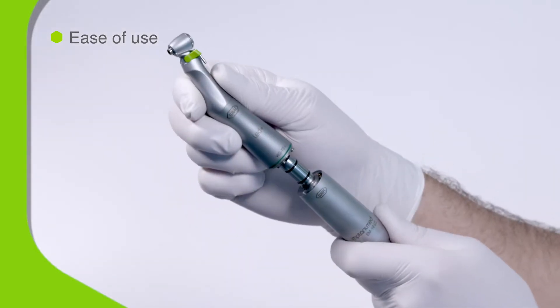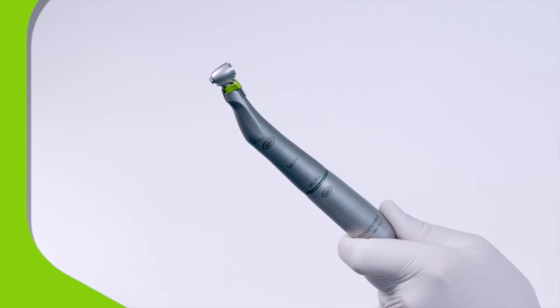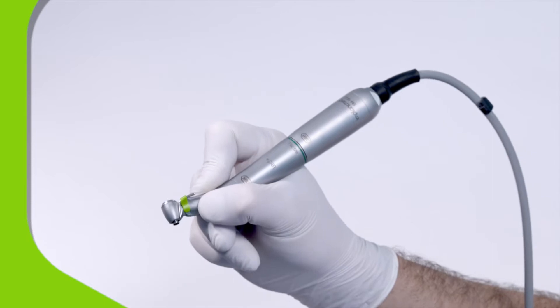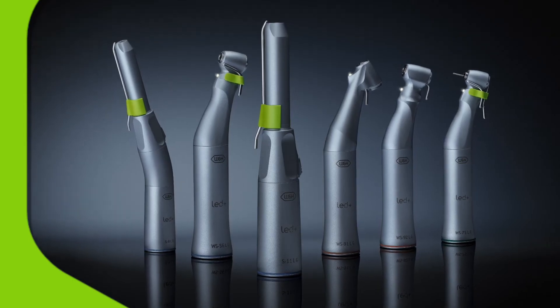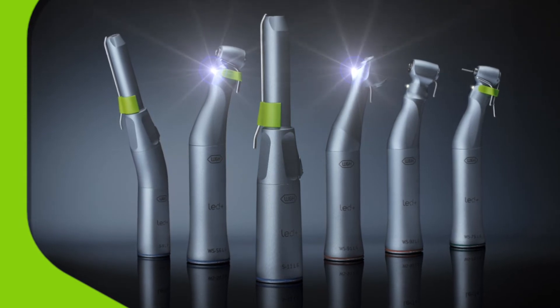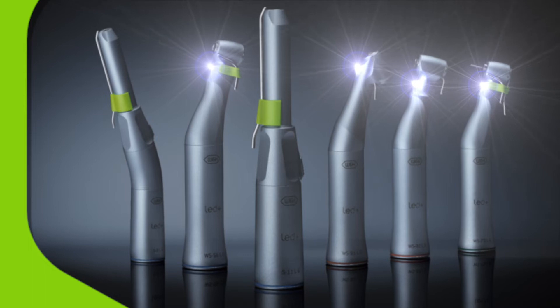ImplantMed is so easy to use because the short motor and ergonomically shaped handpiece work together in perfect balance, letting you operate for longer periods without fatigue. It's easy to see what you're doing too, because this system is compatible with the full range of W&H handpieces, including those with daylight quality LED lighting.